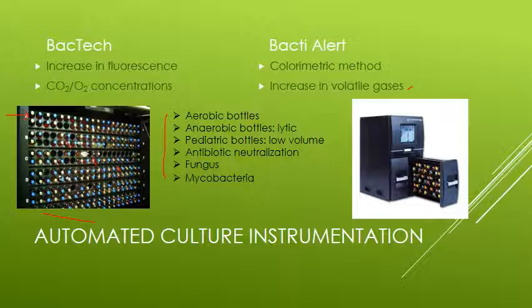We used to have to do it manually, no kidding. We used to have to write down the actual phlebotomist initials. Sometimes you can't read those initials. That's what we did. But again, BacteriAlert has an idea for this. They are actually going to take a digital picture of every single label so that you have the date and time recorded that's supposed to be written on every label, as well as the phlebotomy initials. So that's pretty interesting technology that's added. Some people might think it's superfluous, but as somebody who had to write down those stupid initials and look at every stupid bottle, yeah, I think that's a great idea.